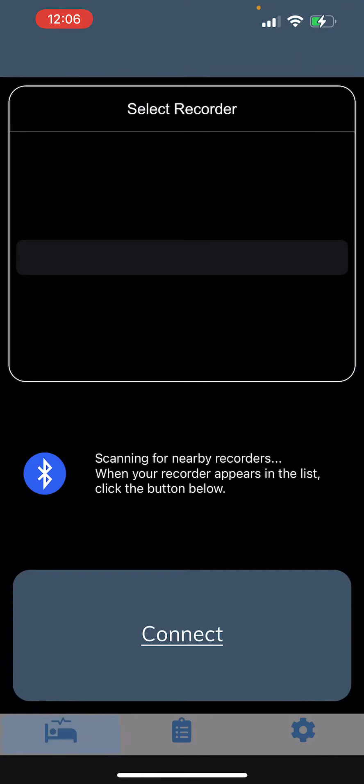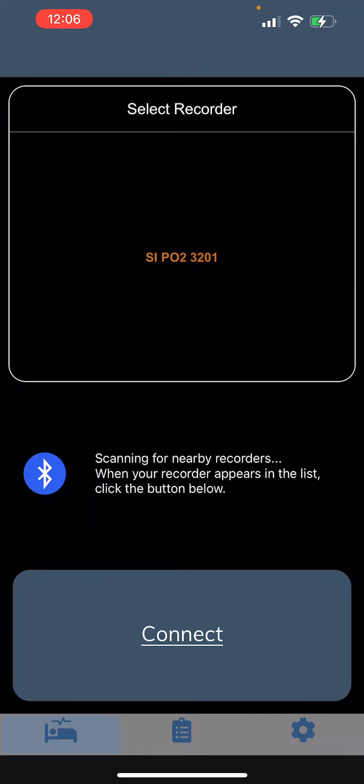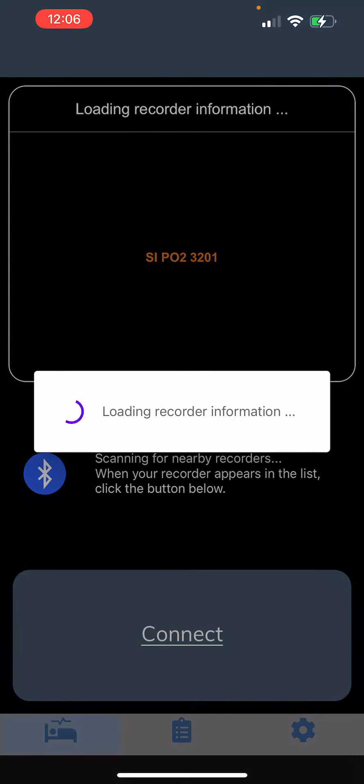Make sure you have your ring nearby so it can connect to it, and make sure your Bluetooth is on. You're going to see your recorder - it's going to be that number right there - and you're just going to go ahead and connect it.